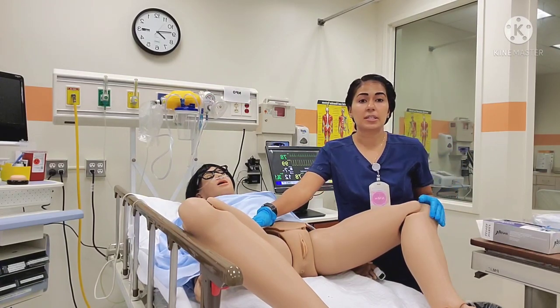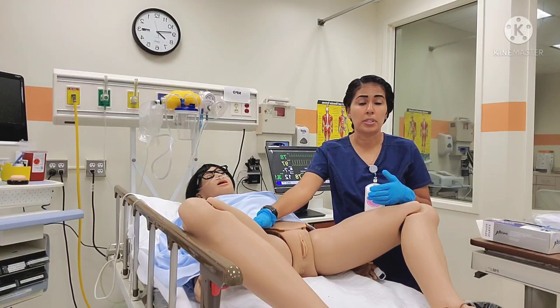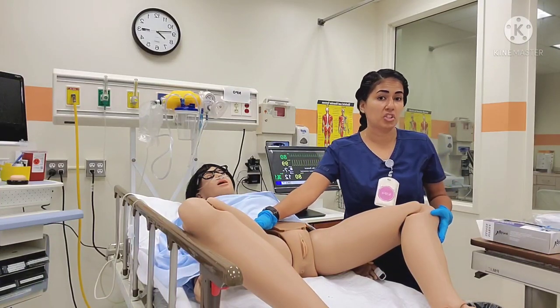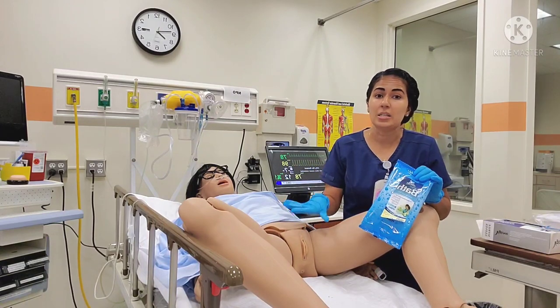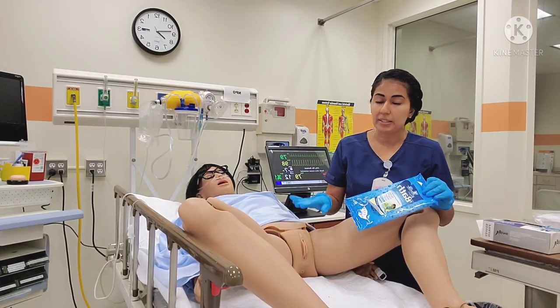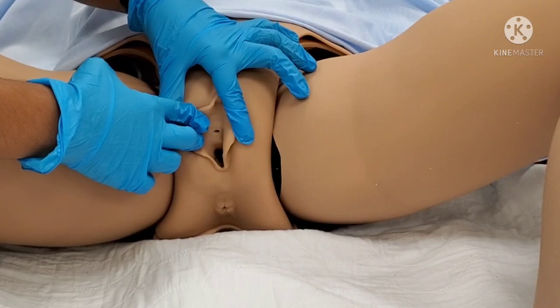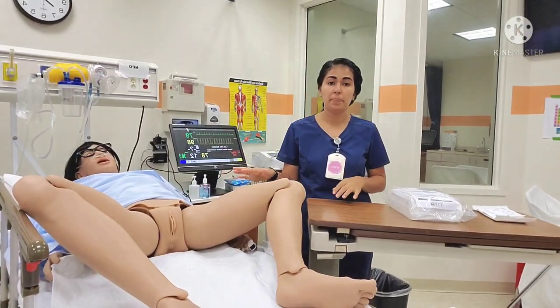In many facilities you now need another nurse to witness, because sterile technique when inserting a urinary catheter is so important to prevent a hospital acquired urinary tract infection. If you don't require a nurse but need assistance, a nursing assistant or patient care tech can help. I'm going to wipe the perineum with the disposable wipes — this is the best time to start locating the meatus, which is sometimes difficult to find. When I open the labia, the top orifice is the meatus, the next one is the vagina, and lastly the anus.